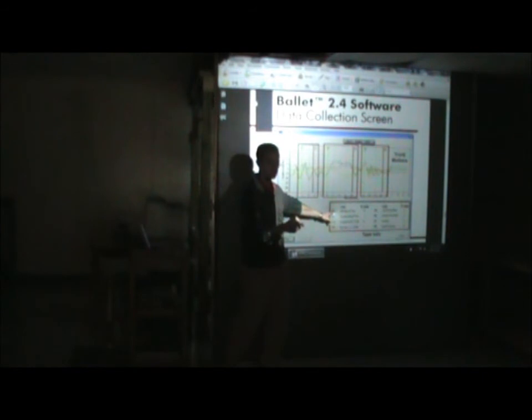Hit it again, it'll stop collecting. Let's say the next task was different. You hit F2 to start the beginning of that lift, and hit it at the end. Or if you're doing 3 trials of that first task, you'd hit F1 to start, F1 to stop it, whatever they're doing in between, F1 again to start, F1 to stop it.